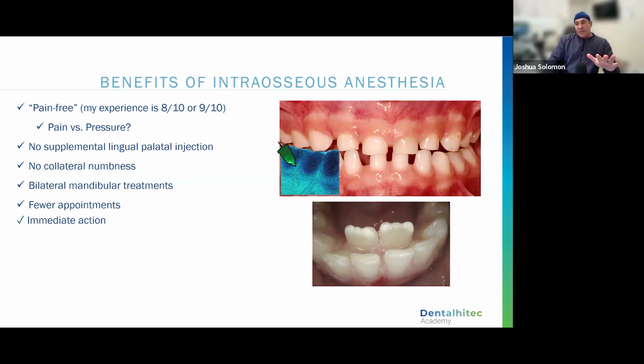Now, it's a little disconcerting when you first do this. I was a little concerned that that truly was going to be the case. And just a quick suggestion: if you have a patient that you've already done a fair amount of treatment, or you've completed one half of their treatment with a standard needle, and then you go to IO for the other side, please make sure you tell the parents that there's a difference that day, because I did have one mom immediately. She wasn't so happy.